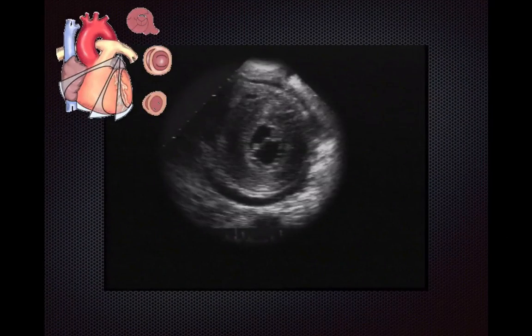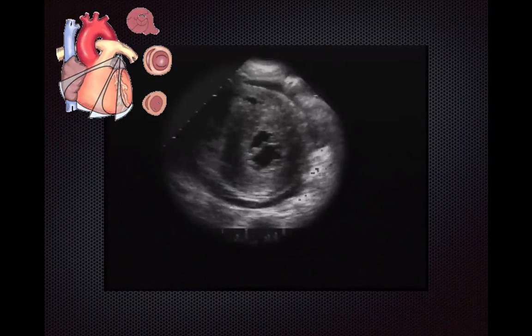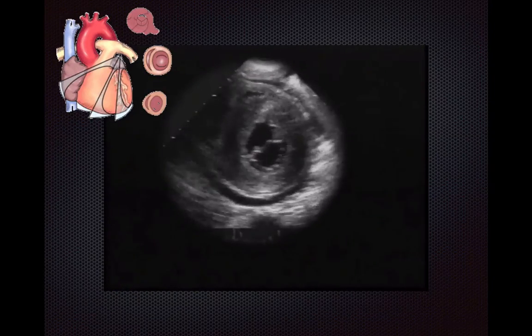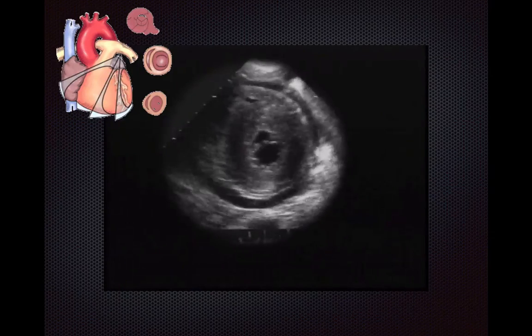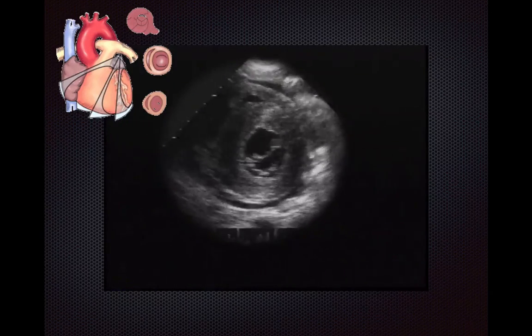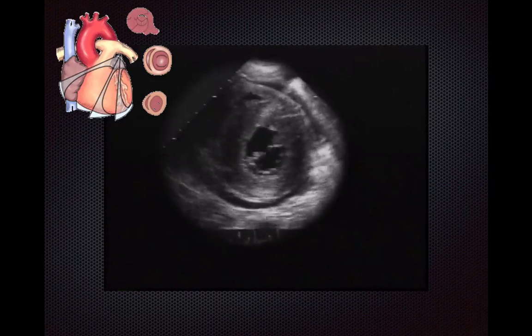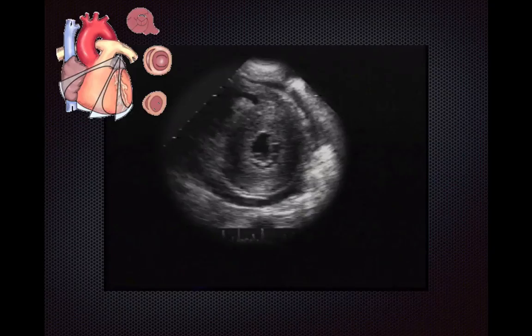Here we have the mitral valve view. Again, this is the parasternal short axis, but now you've just angled the probe so that you're right over the mitral valve and you get what we call the fish mouth view. Again, in this image, you can also see a bit of fluid around the ventricle, a small pericardial effusion.